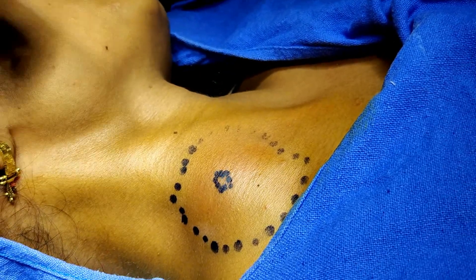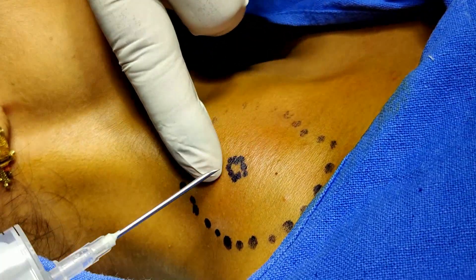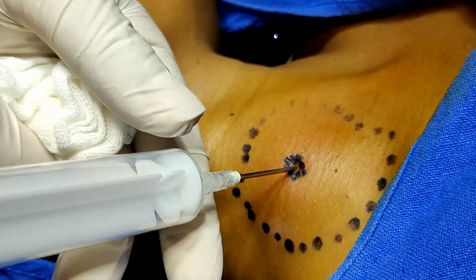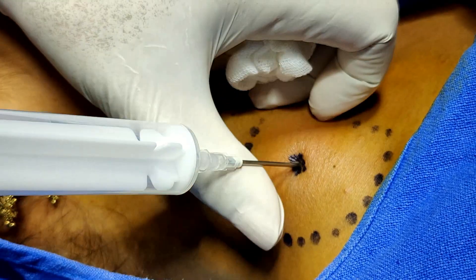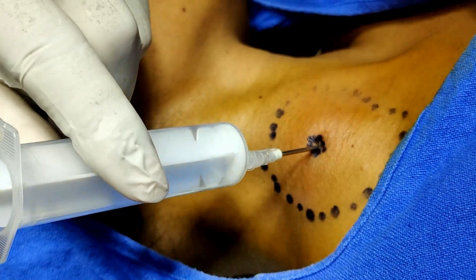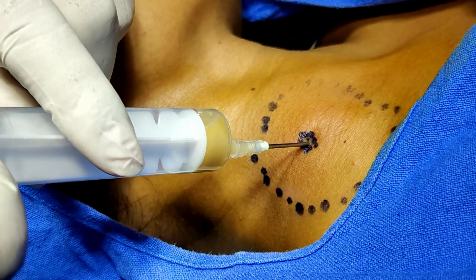I am again inserting the needle. This is the sternocleidomastoid, and this is the most prominent part. I am inserting the needle in a transverse direction and now aspirating. This appears to be a tubercular abscess — this is tuberculosis.